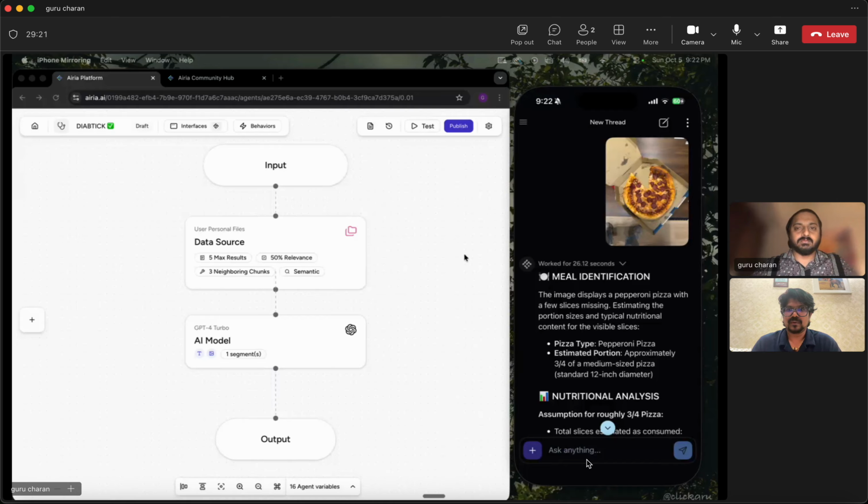So we wanted to develop an app which will solve this problem for them. Take a picture of the food plate or bowl and send it to our AI enabled app that is deployed in Airia, that will instantly give the amount of insulin they have to inject before taking that meal. So it is that easy.